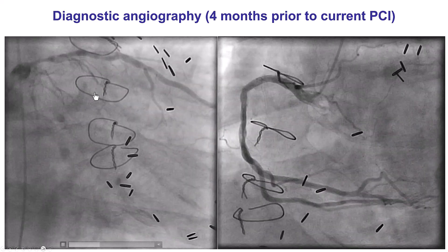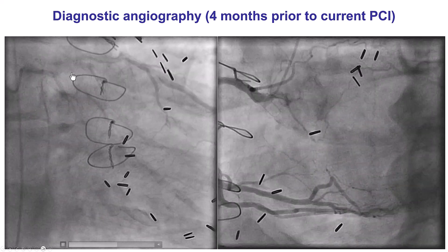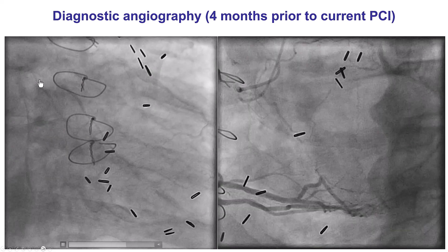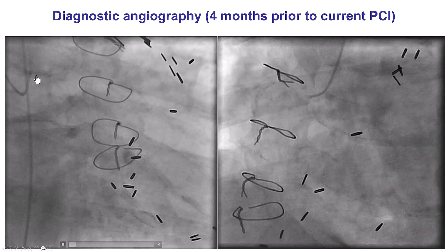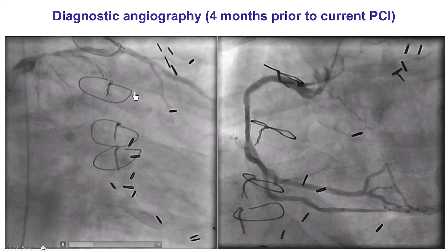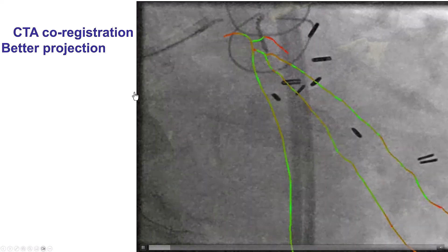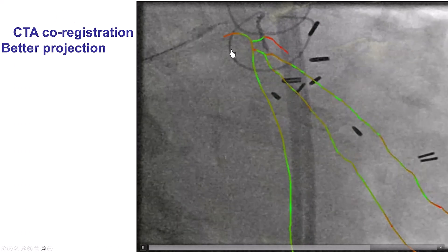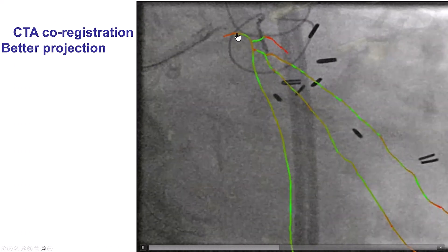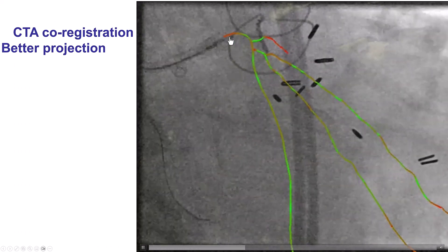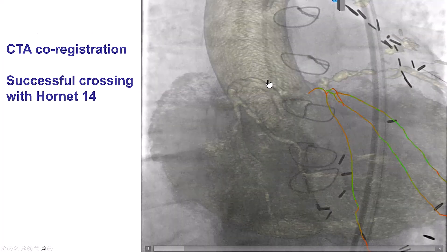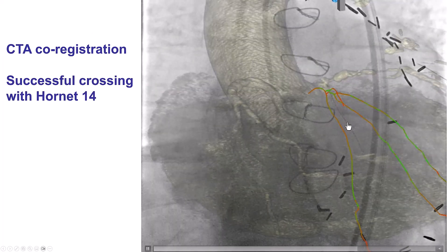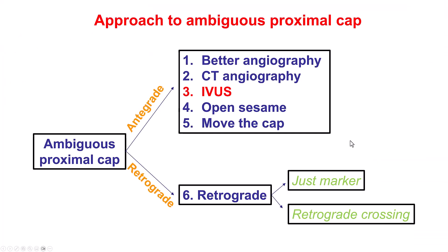This is an example of a patient who had a diagnostic angiogram before and has a CTO of the circumflex. In cases like this, we can also do what's called CT co-registration on the Siemens system, in which we can have an overlay of the CT findings with the current angiogram and use this as a guide to advance our guide wire, and this allowed us to cross the occlusion.